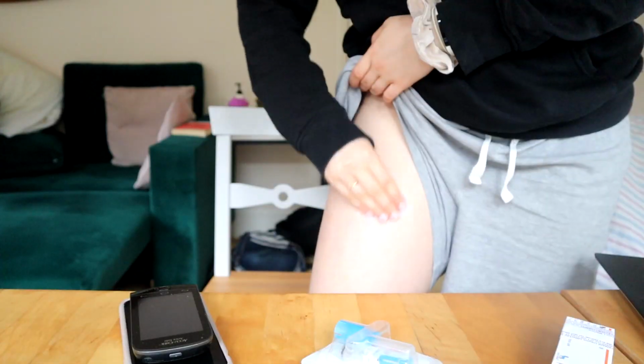And then with the infusion site, it is very personal. My infusion sites become quite dodgy after 2 days, so I have to change mine every 2 days rather than every 3, but it would be a bit of trial and error for you working out how often you need to change. So I'm going to do it in my leg site today, and the first thing to do obviously is clean the site.